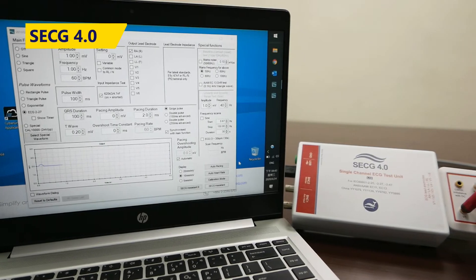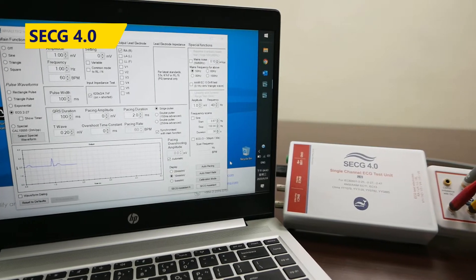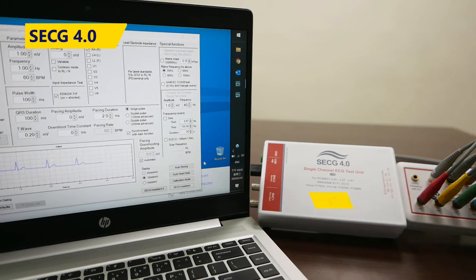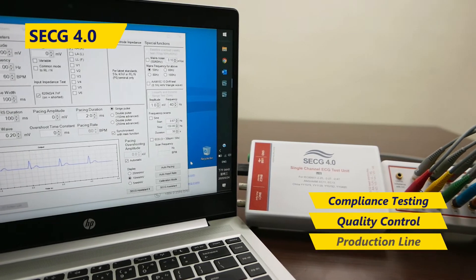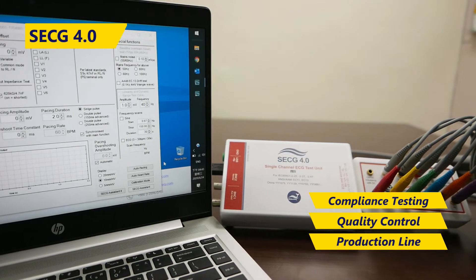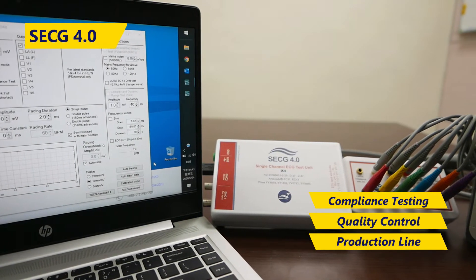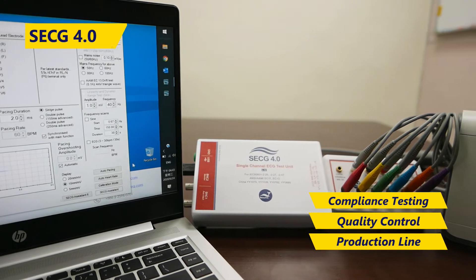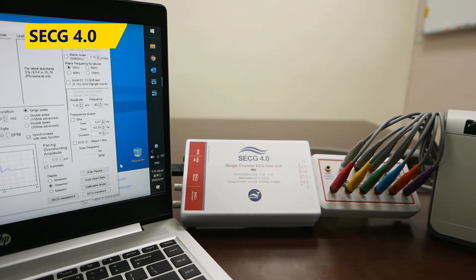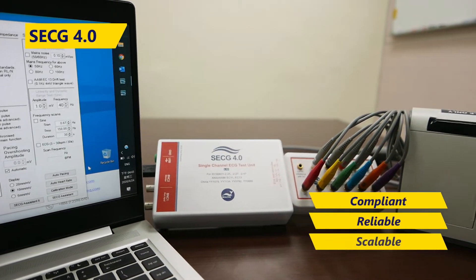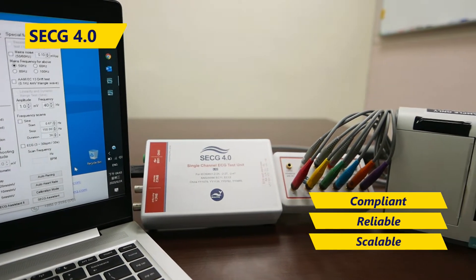Introducing SECG 4.0 by Welltech, an ECG simulator for compliance, QC, and production line testing. SECG 4.0 is designed to make verifying your ECG devices more compliant, reliable, and scalable.